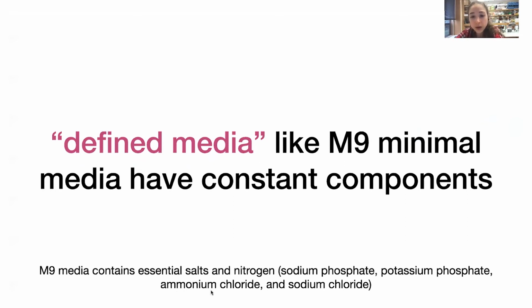If you're like me, you're wondering where the heck the name M9 minimal media comes from. There are 4 components, so that's not where it comes from. Where does this M9 come from? I am going to disappoint you in that I still don't know. I'm guessing that it is the 9th thing that someone tried.